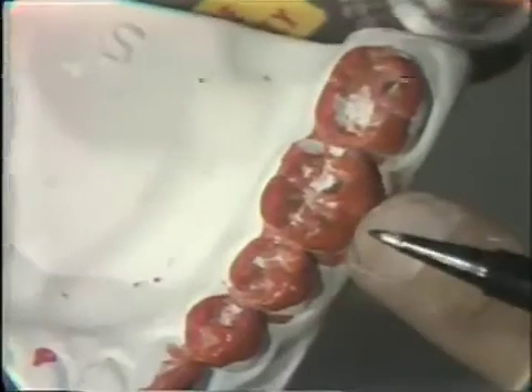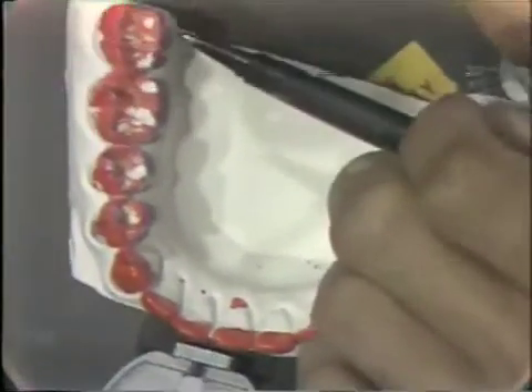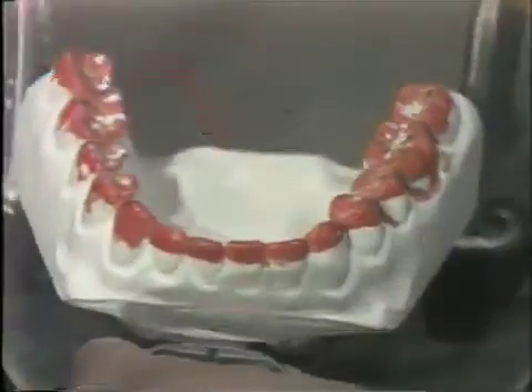One of the ways that I look at the lateral excursion adjustment is to make sure that there isn't an undue removal of the orange paint from these buccal cusps on the lower, which would mean that you have been doing unnecessary grinding down on the lower. On this side, we'll notice that we have paint removed on the buccal aspect of the lingual cusp of the lower teeth. This is both for adjusting the centric as well as the working adjustment, so this is an area that may be ground for lateral excursion. On the buccal aspect, there is no removal on the working or the balancing side on this right-hand side.